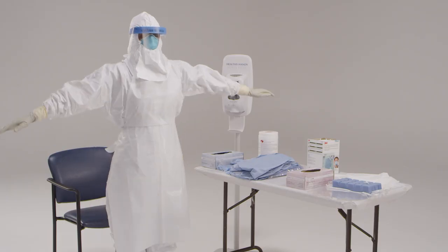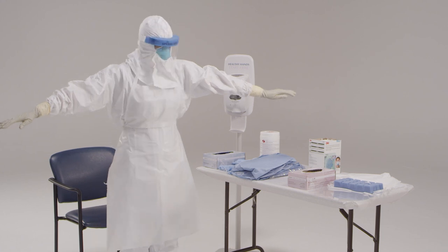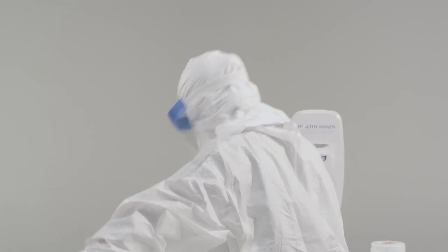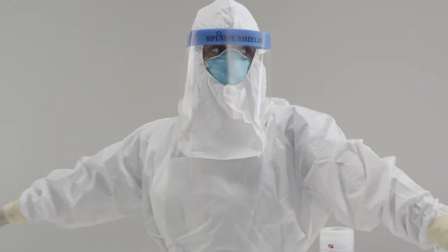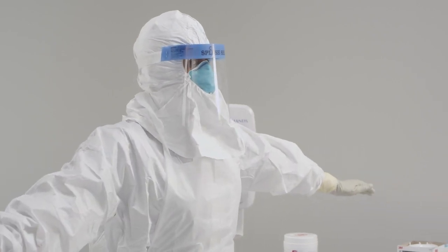Now I want to make sure you have full range of motion. Can you move your arms? Can you bend at the waist? Can you turn around a little bit so I can make sure everything is ready for you to go? After completing the donning process, the integrity of the ensemble is verified by the trained observer. A mirror in the room can be useful for the healthcare provider while donning personal protective equipment. Everything looks great. Now we're ready to take care of the patient.